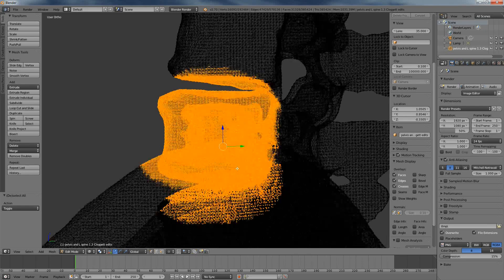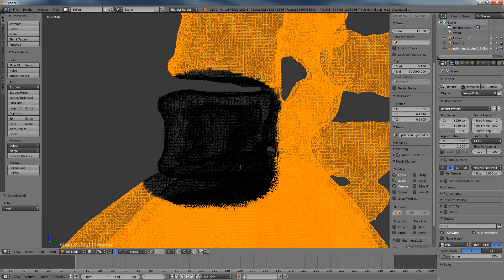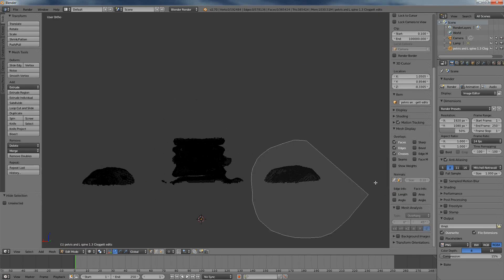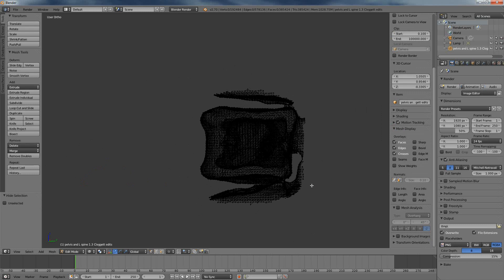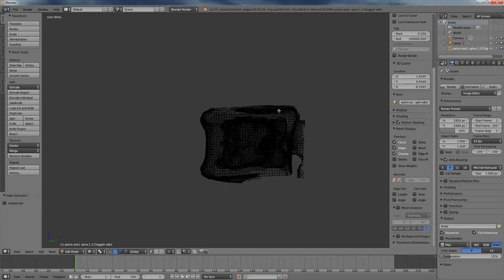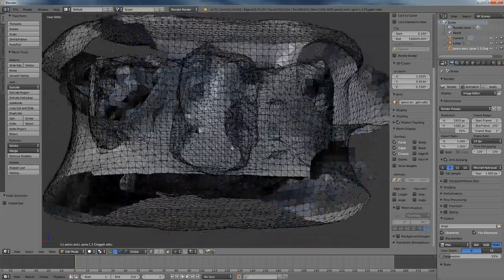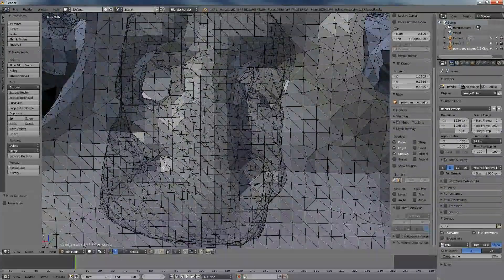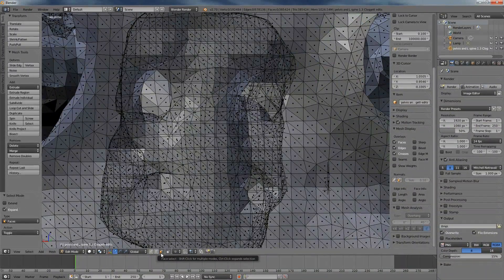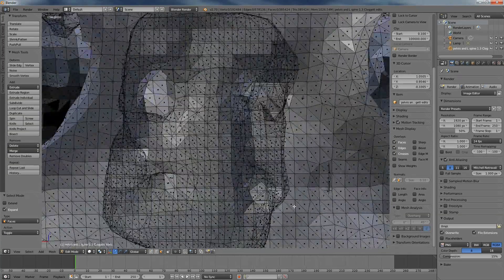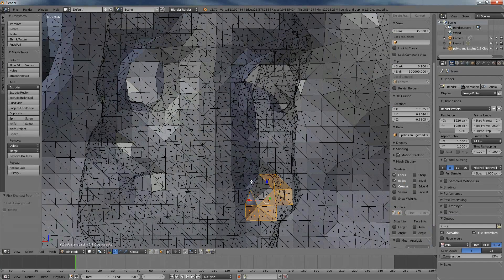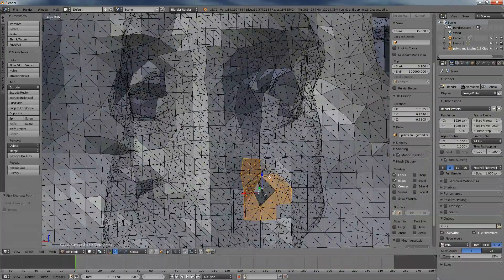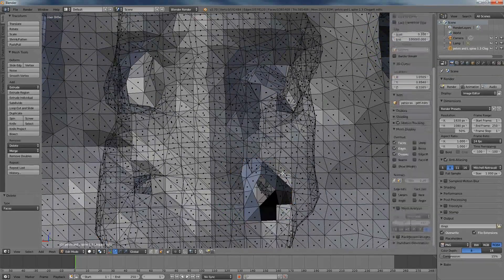Let's do the process again briefly. Control I inverts the selection, H hides it. I'm going to go over here, select this, hide that, select this, hide that. Probably hide that, hide that. Make it easy for yourself and get rid of as much extraneous mesh as you can. And then, here we are already. This one looks like it has four holes to repeat the process. Go to face select mode. You can select it over here or hit control tab and numeral three. Select around your area and it's okay if you get some extra faces in there.